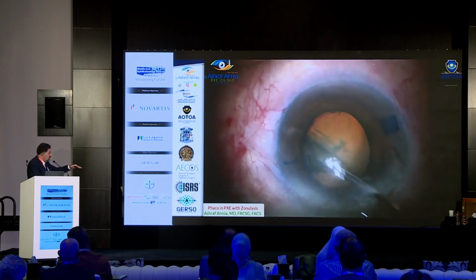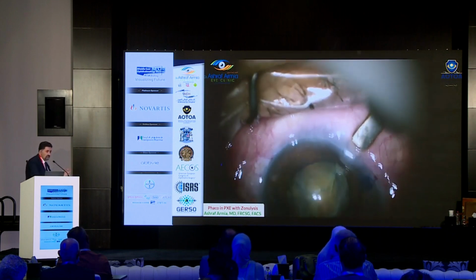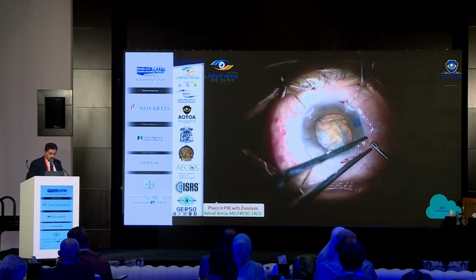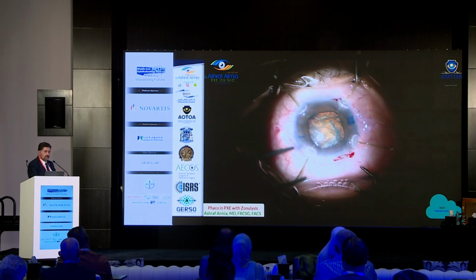I did hydrodissection, but during rotation, see, all the nucleus with the bag is moving. So don't say, I am an expert surgeon, I am going to take it without anything. This is a mistake that can happen to any one of us who feels confident doing surgery. So maintaining your capsular bag in these cases with the capsular retractors is a safeguard for you. So I put my four capsular hooks, and then I continue the surgery.